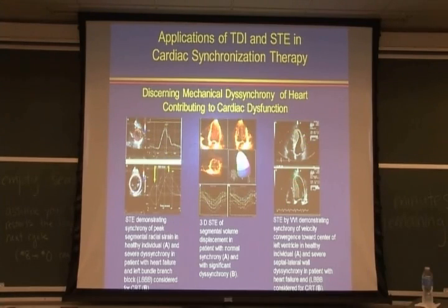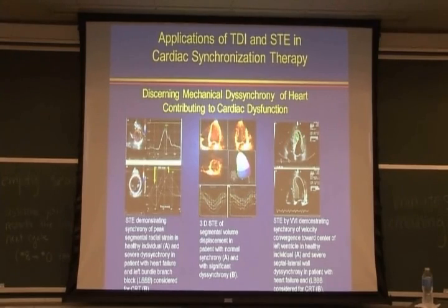This is another modality where you can measure the myocardial deformation, what we call velocity vector imaging, where besides the Speckle tracking, you are also measuring the motion of the different segments of the heart moving away from the center of the cavity or moving towards it. Myocardial deformation is depicted by all these arrows, and the direction of the arrow provides the direction of the wall motion. So this is the normal, this is abnormal.